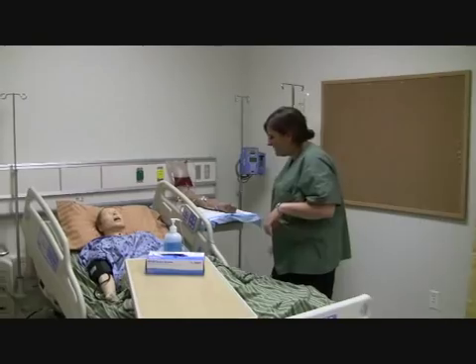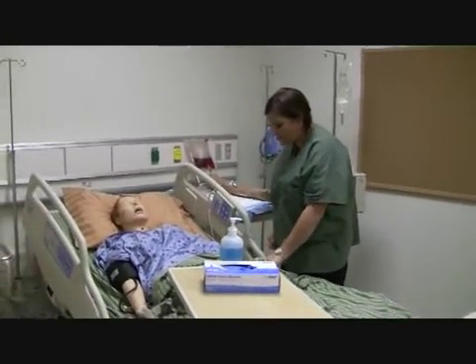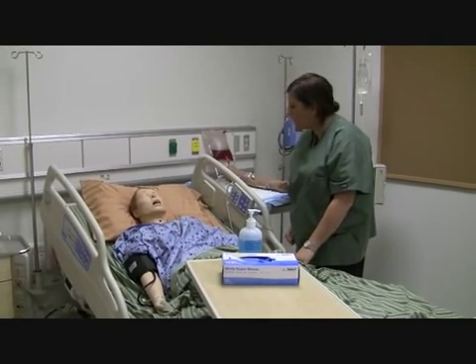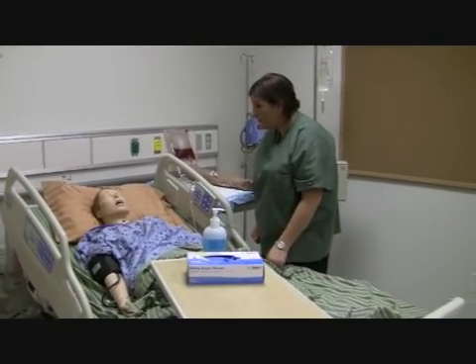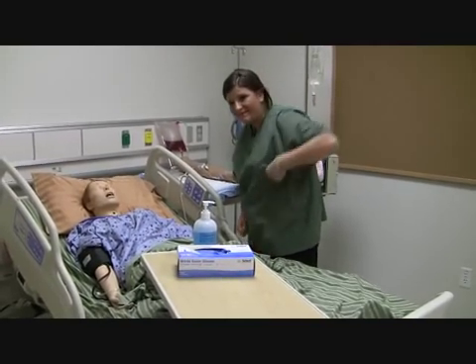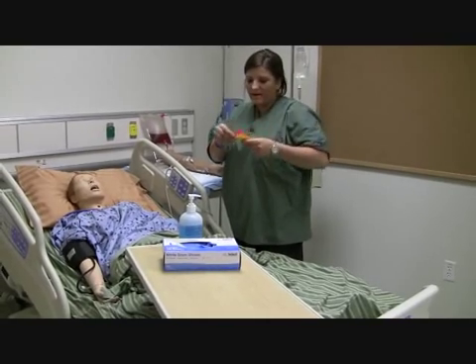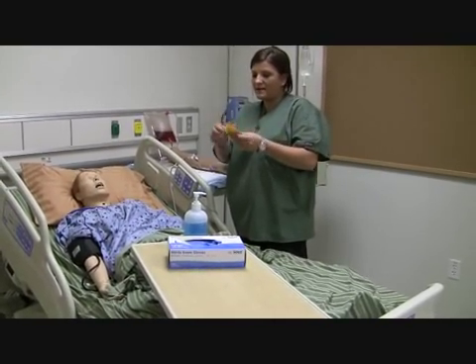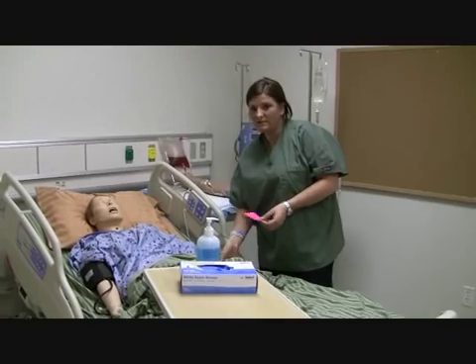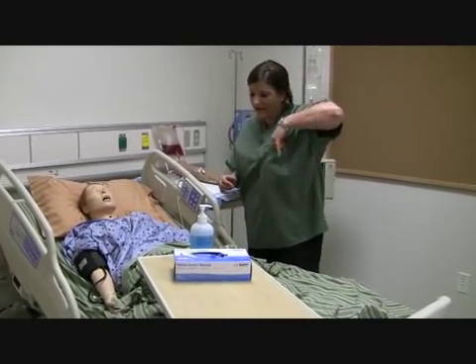Okay, so hi, Mrs. Jones. I'm Rachel. I'm going to be your nurse today. I need to ask you, can you tell me your full name and birthday? Do you have any allergies? Okay, sulfa allergies. I'm also going to do an extra check, make sure the card matches the patient, so everything's correct. And it does.